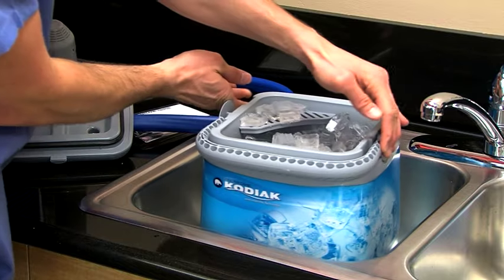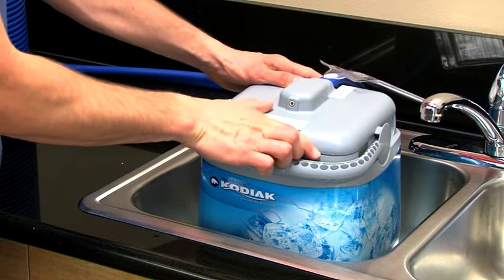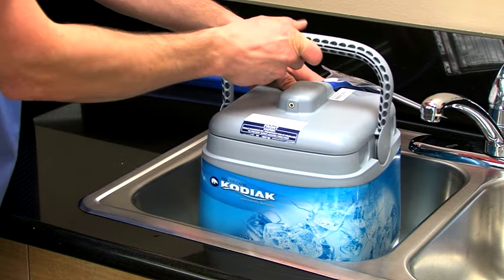Once filled, place the lid on the Kodiak with the hose pointed away from the product descriptor and lock the lid into place with the handle.